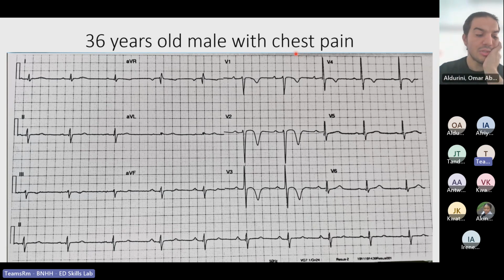As I said before, all the patients went to the cath lab and were found to have acute ischemia, and they were mandated to have stents. Anyway, looking at the ECG rate, to my eye, I think it's more towards the bradycardic side.